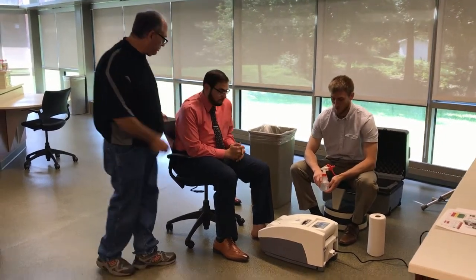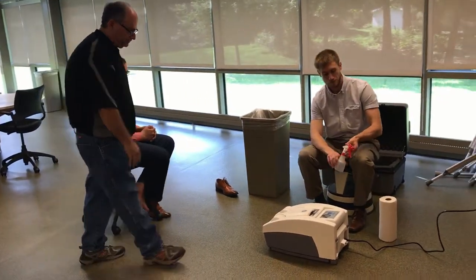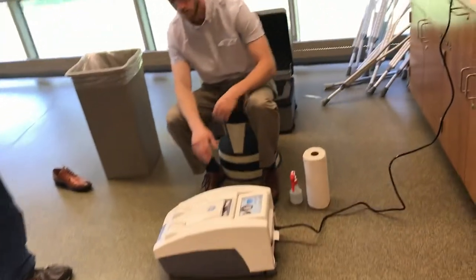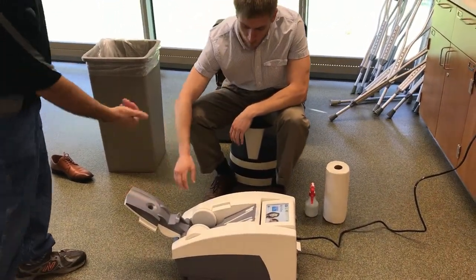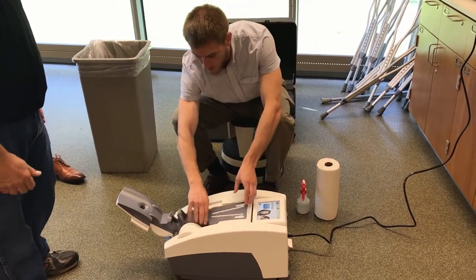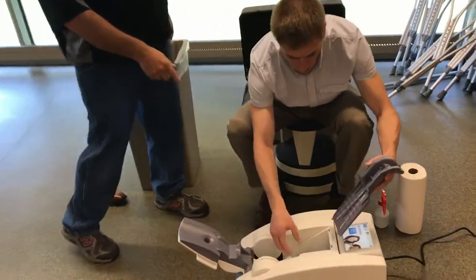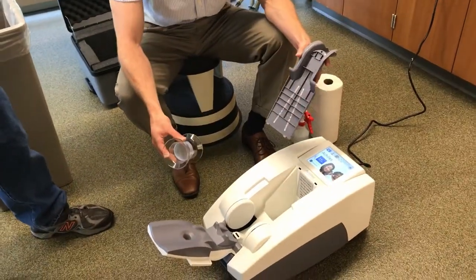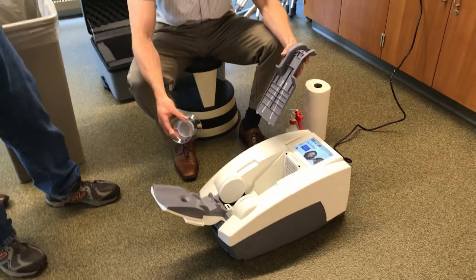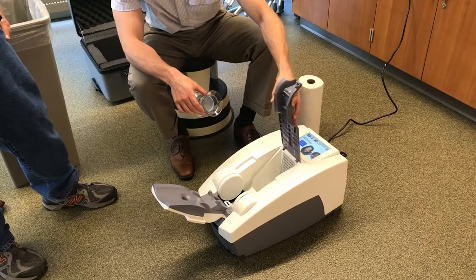Since we're going to run the QA first, we'll have our patient roll back out of the way — we're not going to need the patient yet. Go ahead and have the pharmacist lift up the calf rest, then lift up the foot rest and tilt it up, and remove the phantom device that was stored in there, because that's the device we use to perform the QA. Go ahead and put the foot rest back down — not the phantom, but the foot rest — and then lean the back like it was.